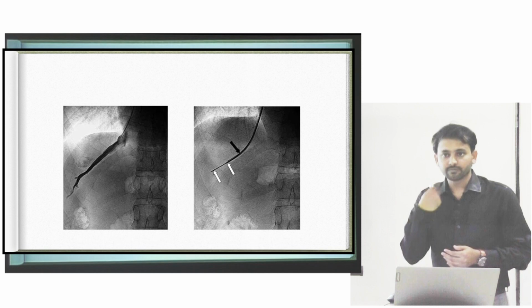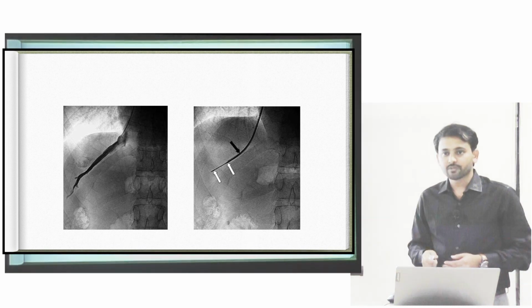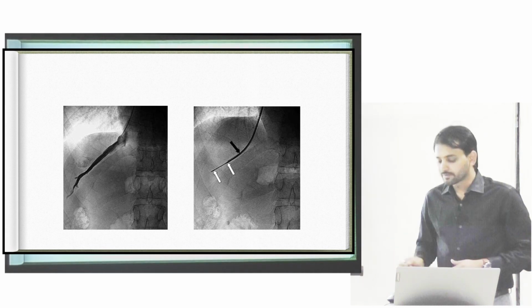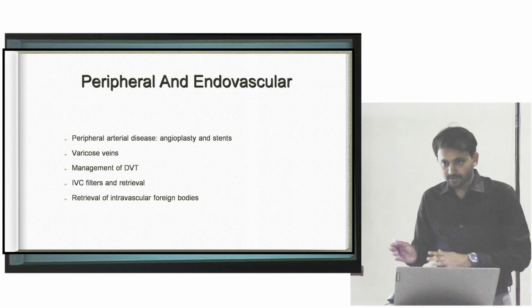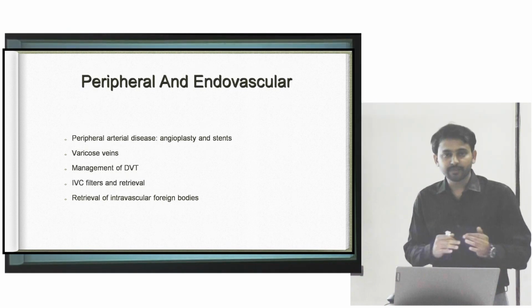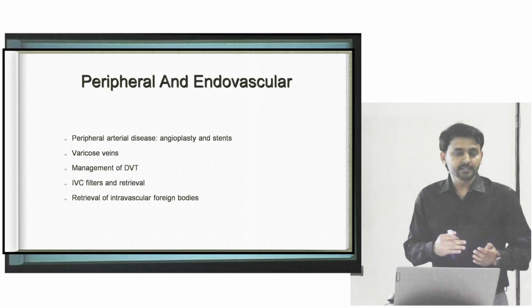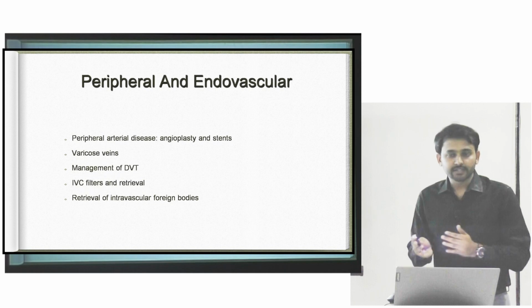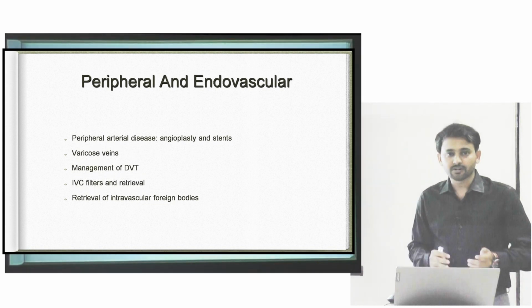We approach from the IVC into the hepatic vein and take samples from the liver. With this I am concluding the diagnostic part. Almost any lesion, even small or difficult access, we can sample without any further damage to adjacent organs and viscera, to avoid major complications.